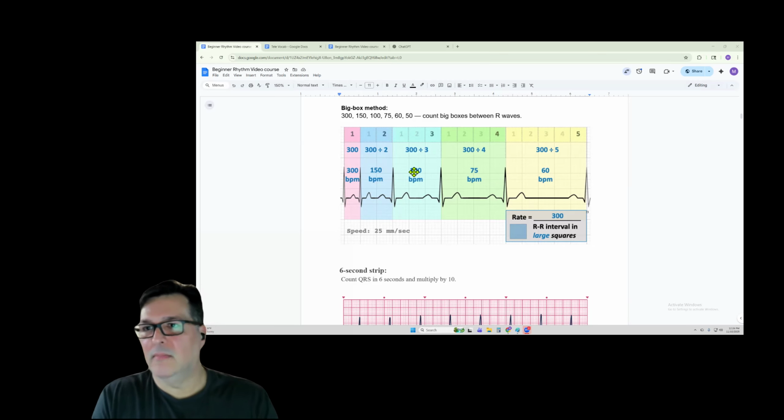Sorry, you had a question there? No, I like how when we were doing the flutters yesterday, you equated that ratio to those numbers. That helped me see it too. Like the 2 to 1 being exactly half. The one was half of that.